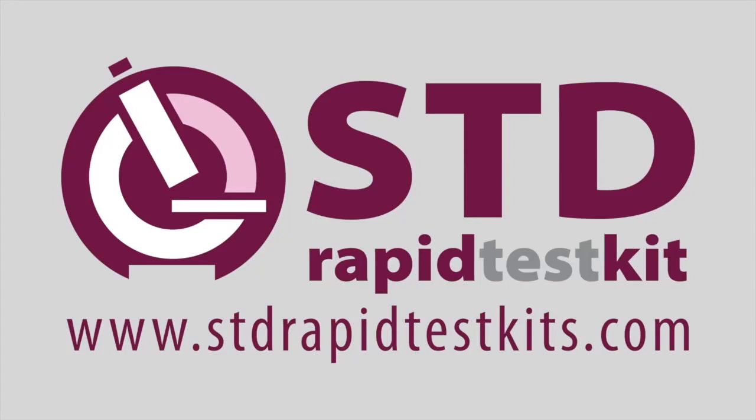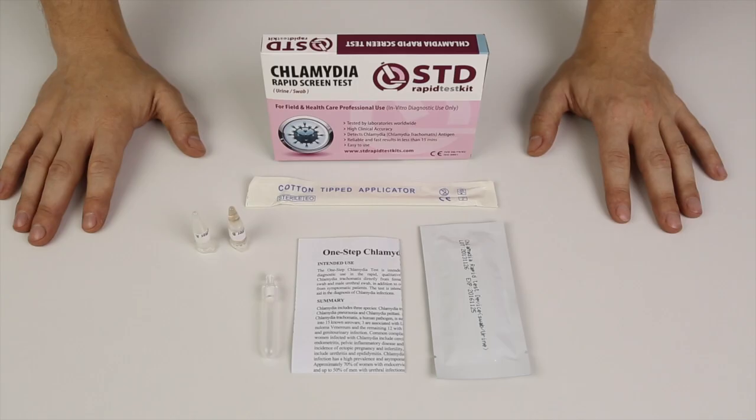Hello everyone and welcome to the tutorial for the STD rapid test kit for Chlamydia. Today we're going to illustrate how the test is carried out, show you the content of the kit, and explain what the different parts are.